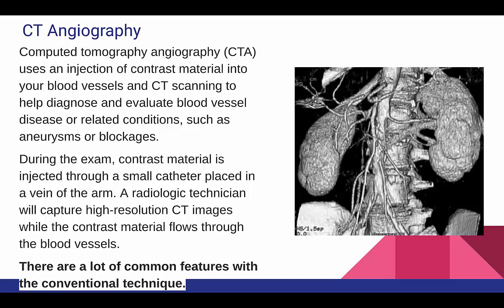However, the conventional method always provides better resolution images, and this is one reason why sometimes doctors prefer that. Another reason is that this is an older technique, hence it's still preferred by some of the older doctors because they feel more comfortable with it.